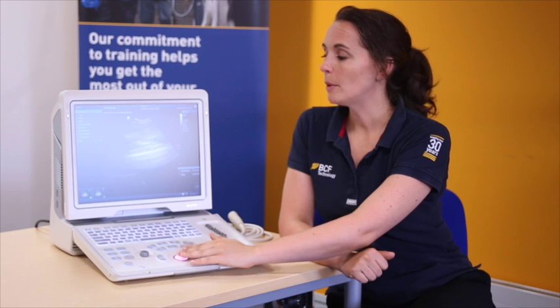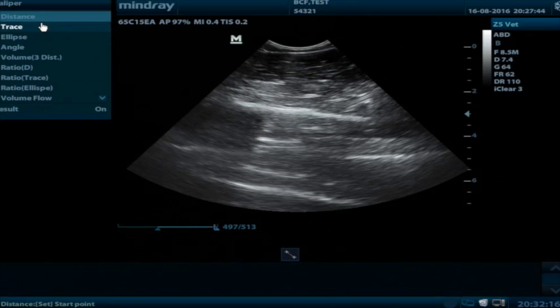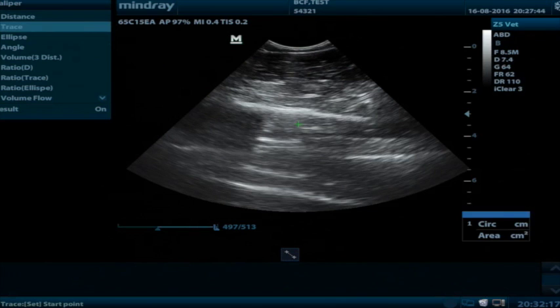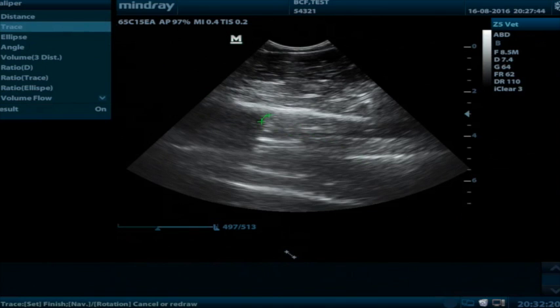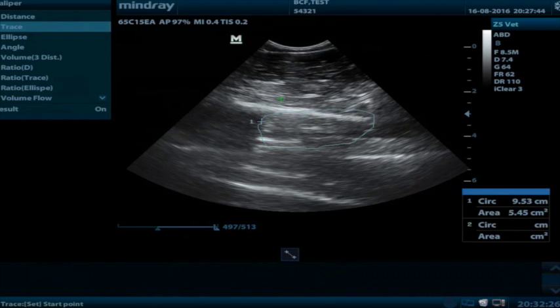Using the caliper we can also do a trace. We can set down the start point and trace around the object of interest. It will then tell us the circumference and area of the structure that we've just looked at.